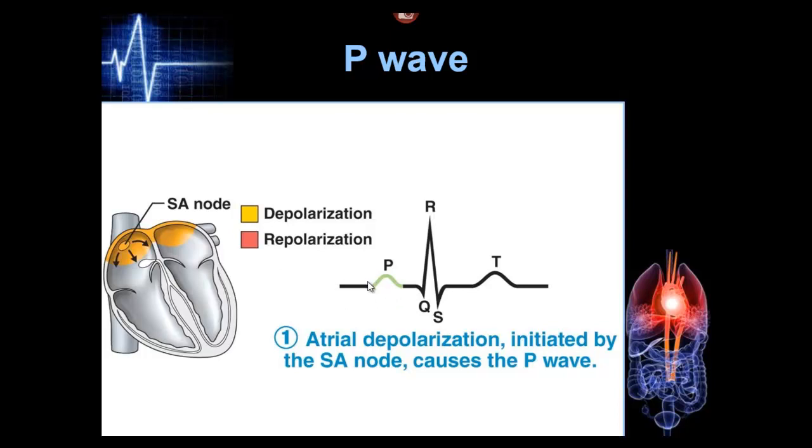And that would actually show up on this machine. Repolarization is ions moving back and forth, so the machine would pick it up. The problem is it happens while the ventricles are contracting, so you can't see it. And one thing I'll just point out, see the little delay here, then it goes boom, boom, boom, and then there's a delay there. This is when blood is flowing from the top chambers down to the bottom chambers, and the bottom chambers contract.